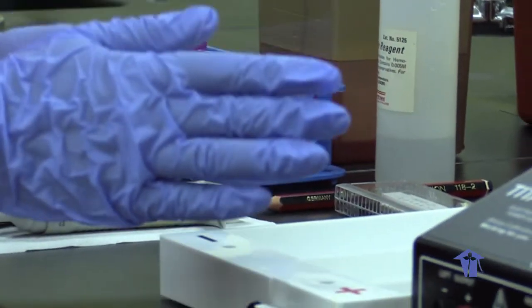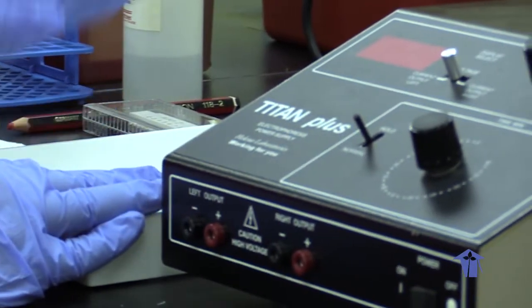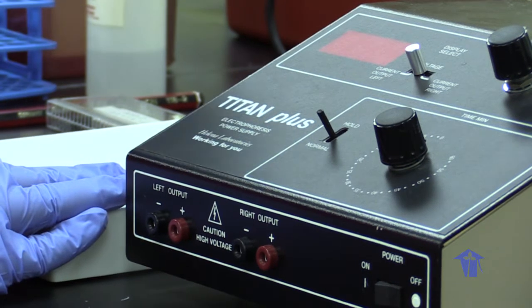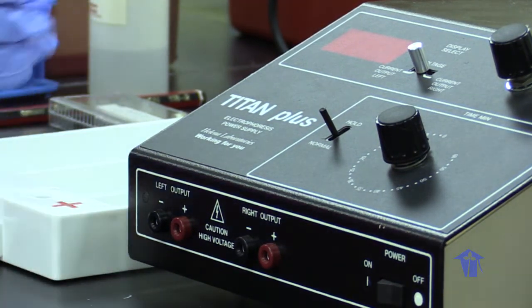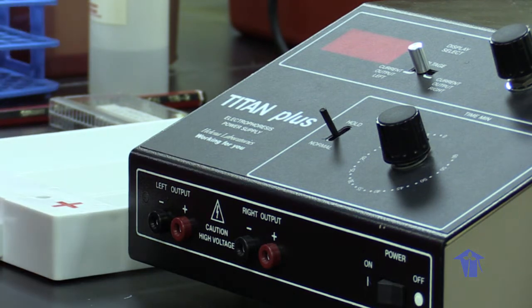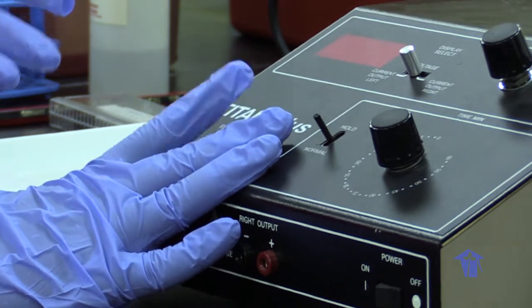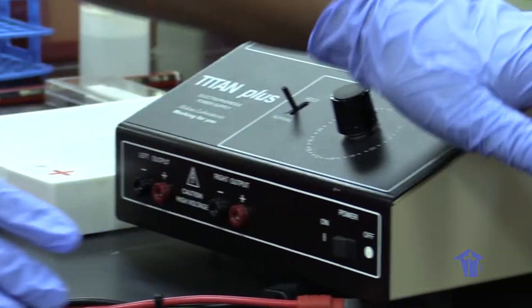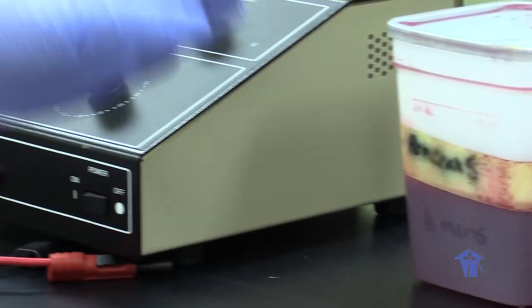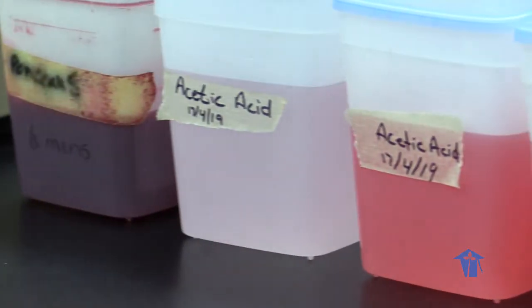Right? We have our chamber that we actually run our plates in. We put our plates in and we get our reaction, whether it's negative or positive, and our bands are pulled in the direction that they are charged by the electrophoresis power supply. Then we have our stains. Right, so that is the process. We set up our sample, we put it on the chamber, and we stain them, then we dry our plates.